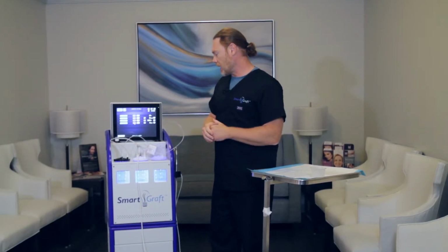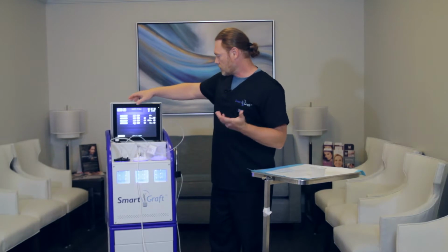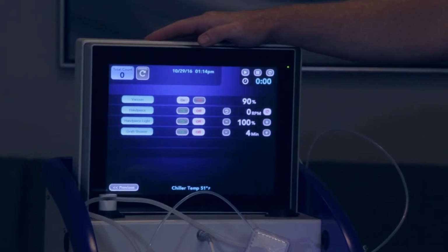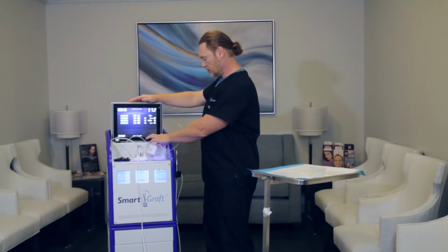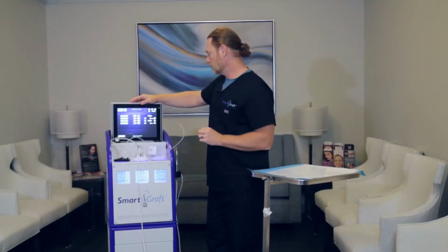You do have the graft shower that you can turn on and determine how often you want the saline to spray. So let's start off first by hitting the vacuum. And you want to make sure that it gets very close to 100%. If you see that it doesn't get close to 100%, the easiest thing to do is it's probably just this little tiny filter just needs to be pushed in a little bit more, this tube.